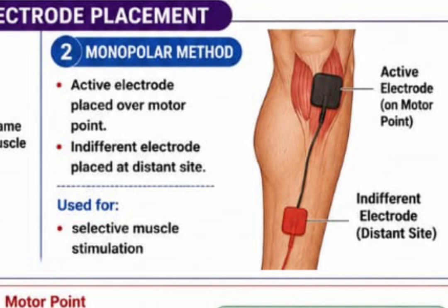So you want to pick out a specific muscle, and the muscle is not big. Bipolar placement is not really only used for small muscles, it can also be used for big muscles. So, correcting a typographical error, the bipolar placement could be used for big muscles too, while the monopolar placement could be used for selective small muscles. So don't forget it. Bipolar, two of them on the muscle belly. Monopolar placement, one on the muscle belly, one distant away from the muscle belly.